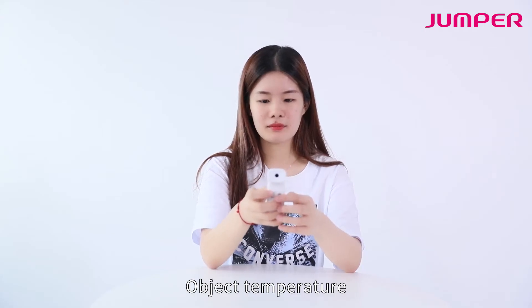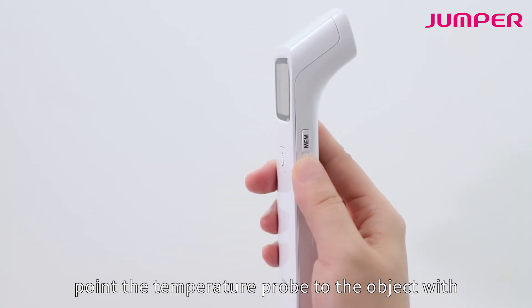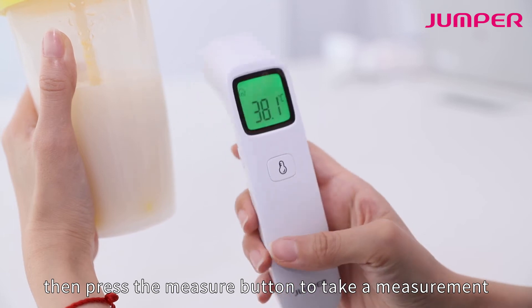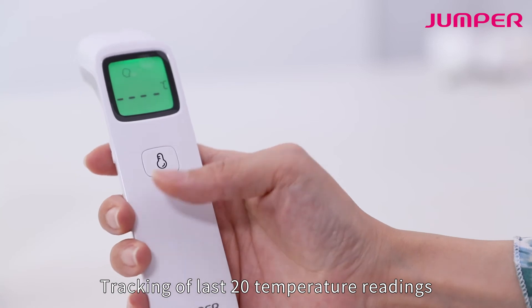For object temperature, press the mode button to choose object mode. Point the temperature probe at the object with a distance of one to three centimeters, then press the measure button to take a measurement. The device tracks the latest 20 temperature readings.